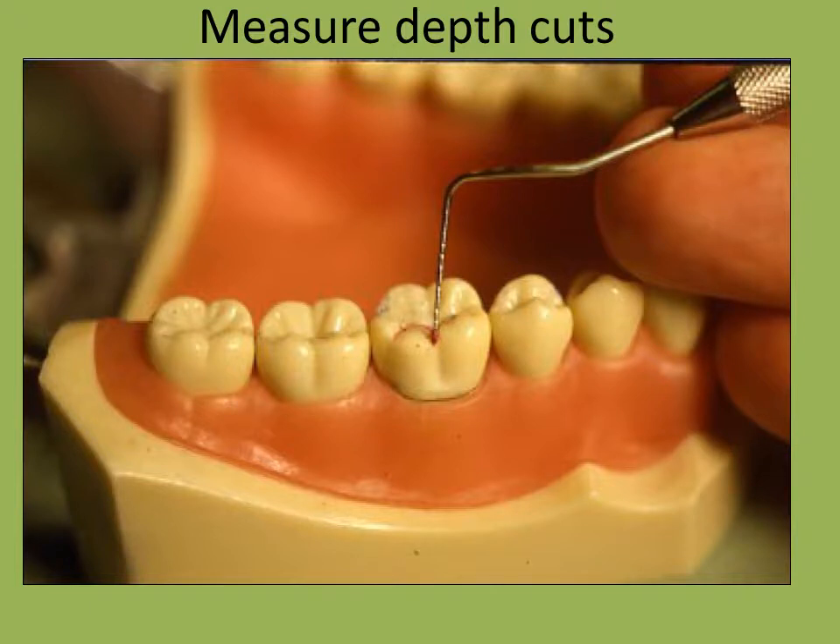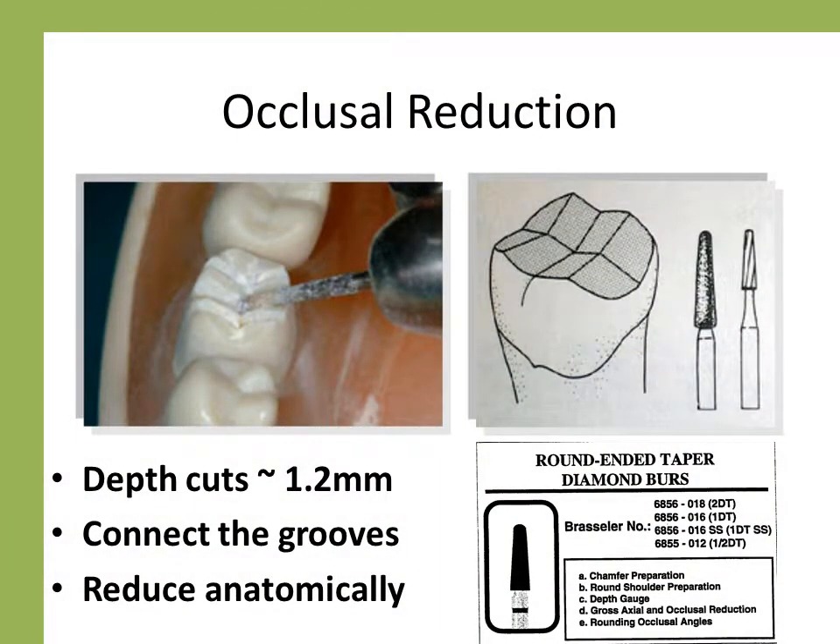Begin the preparation by using the 6856 to produce depth cuts on the occlusal surface. Depth may then be verified with a periodontal probe. The grooves are then connected. The reduction is performed anatomically, preserving the basic external anatomy of the tooth. Reduction may be evaluated with a periodontal probe, bite tabs, or putty reduction guide. About 1.2 mm is desirable. After finishing, overall reduction is approximately 1.5 mm. Slightly less reduction may be placed in the non-functional cusp areas, but the restoration must not be too thin. Some operators advocate slightly more reduction.